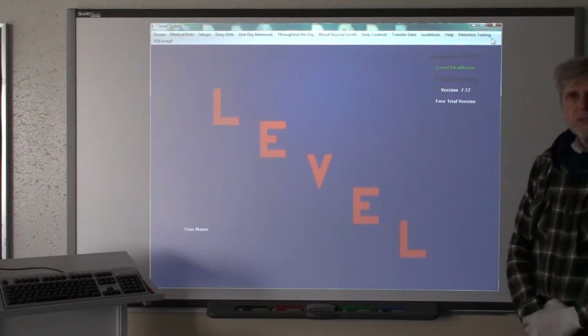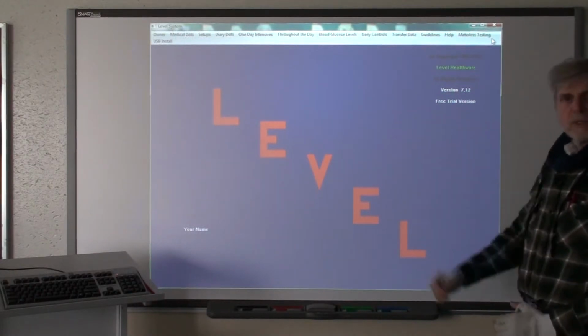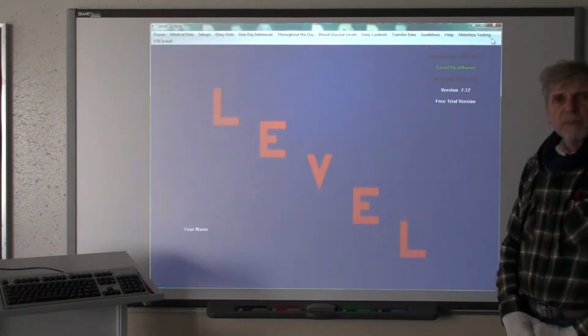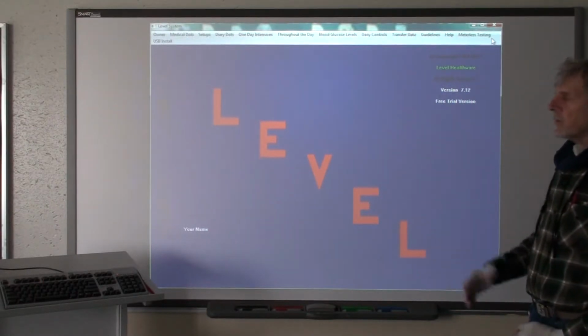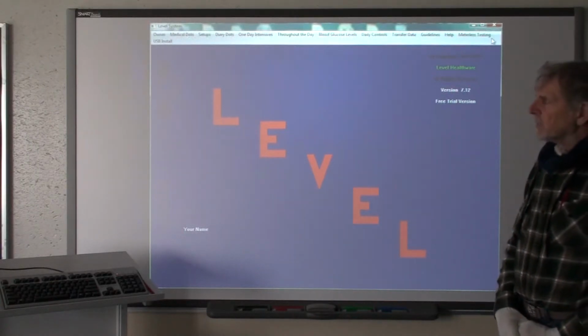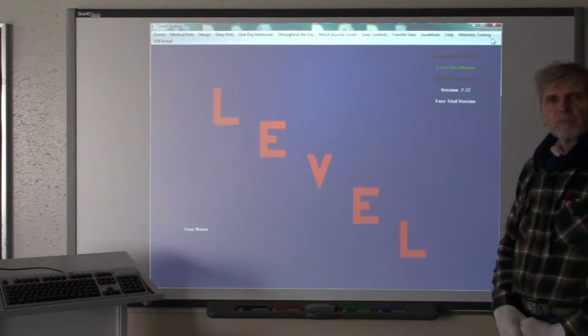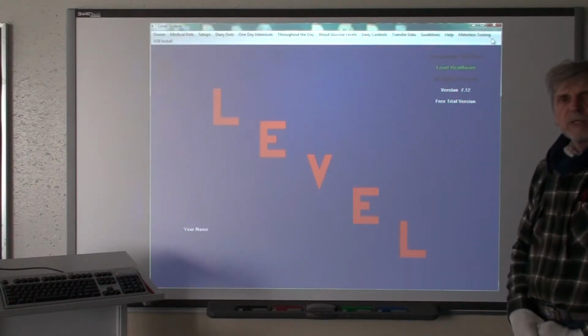Internet data storage means that a current copy of your data is kept at a location on the internet. Each time you finish a level session, the data set as it is at that moment is copied to some location on the internet. The next time you initiate a level session, even on another computer, that copy is retrieved and placed into that computer as your starting point, so that you have the freedom to start your next session at a different computer than you terminated this one at.